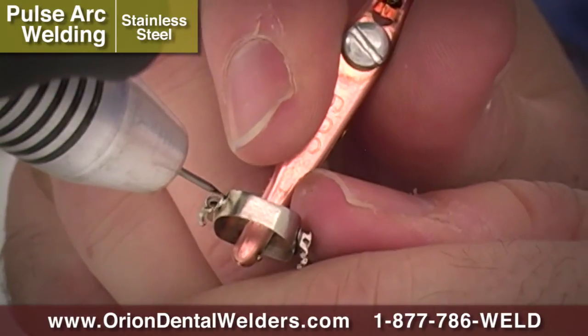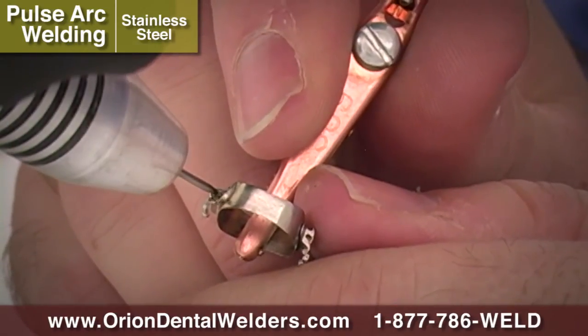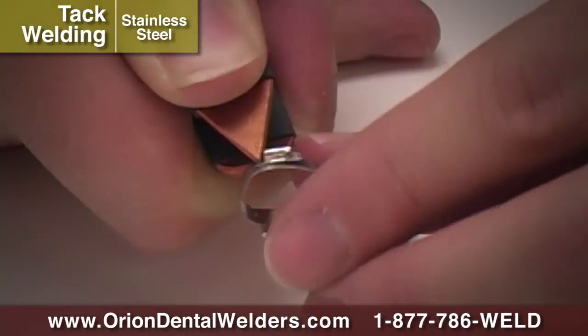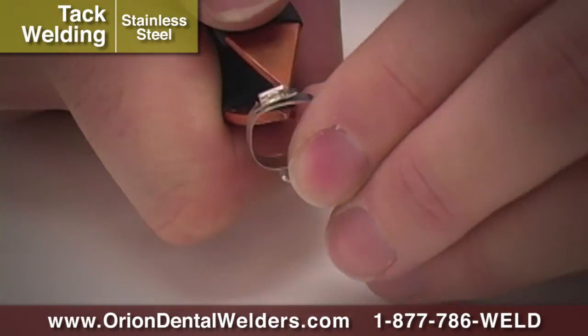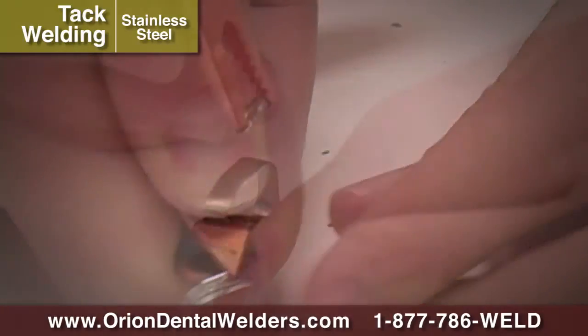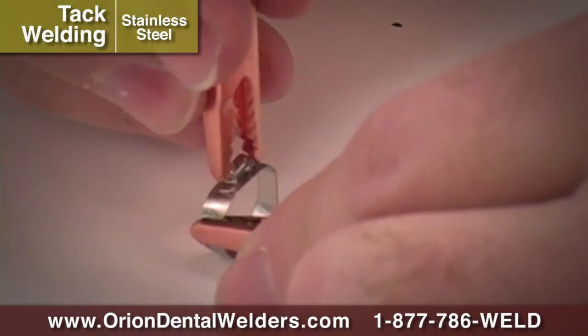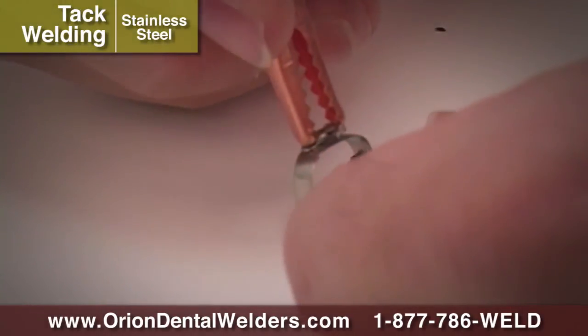The Orion Dental Welder can be used to weld buccal tubes to molar bands in several different ways. In Spot Weld Mode, a tweezer type attachment can permanently weld the parts together. If temporary placement is desired, reduce the spot weld energy to create a tack weld between the two parts.